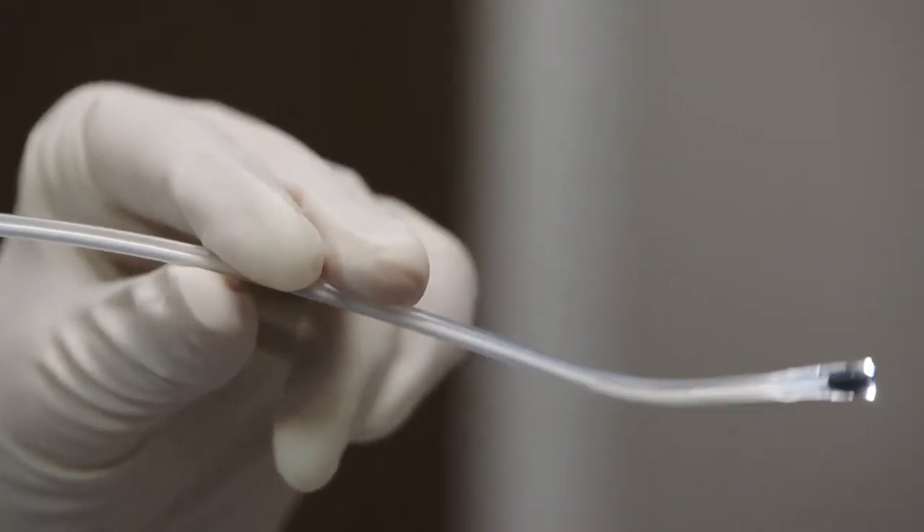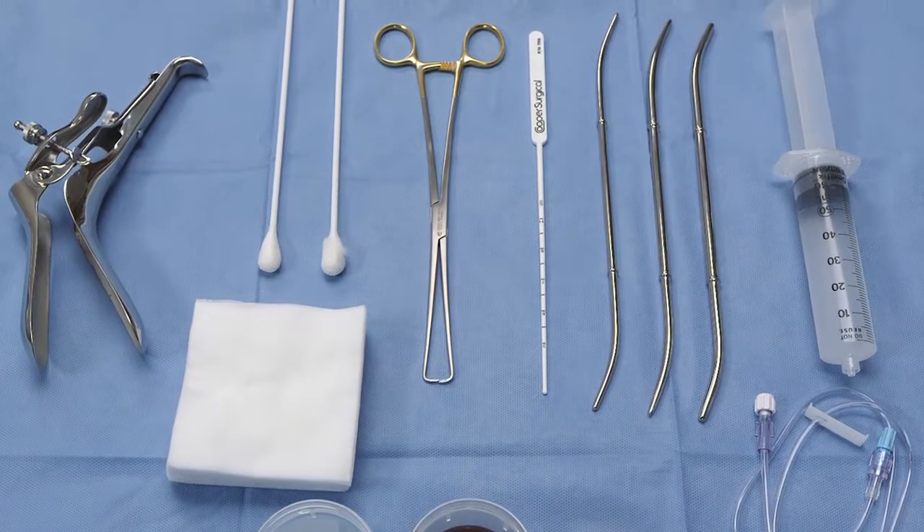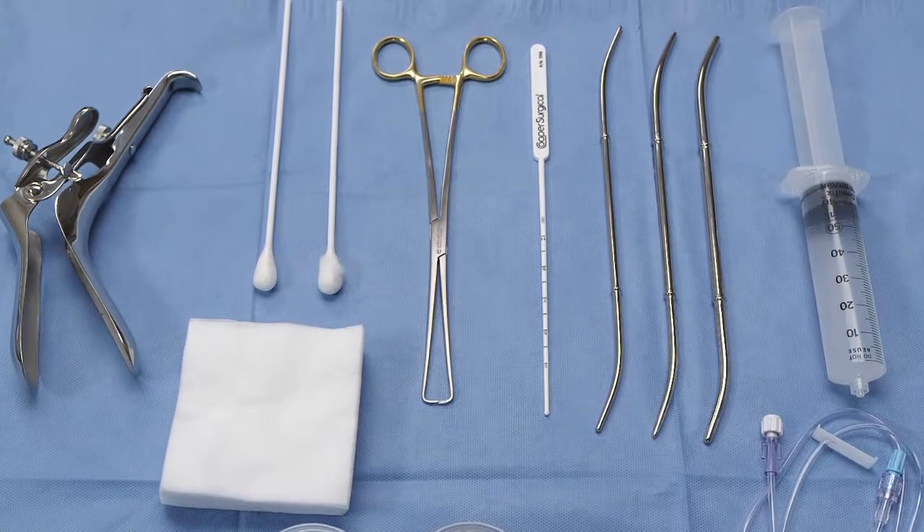The cannula is flexible, so depending on the patient's anatomy, a tenaculum may help you stabilize the cervix and align the cervical canal with the uterine cavity.